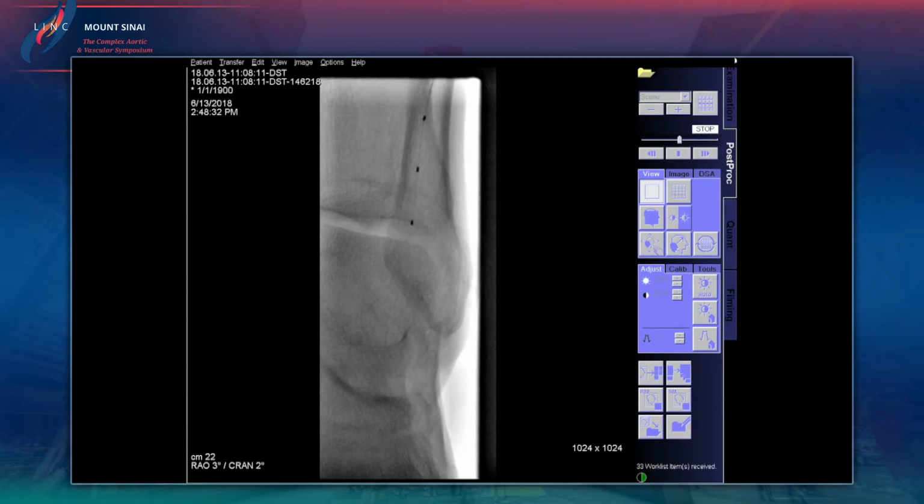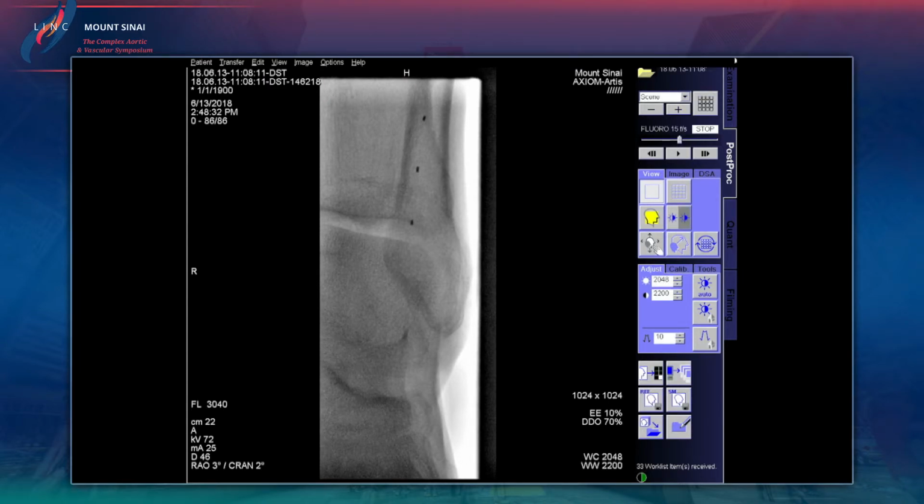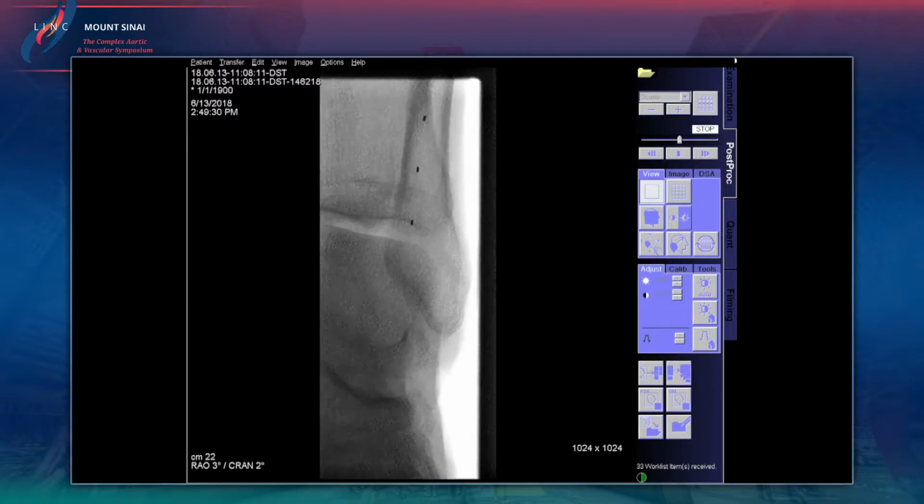So now I've gotten the transit catheter into the foot. So I want to take a DSA in the same projection. Can I have some vasodilators, please? 50. So I'm going to give some nipride into the foot. And I think this is also another important thing that we do a lot. We just give a lot of nipride to be able to see what's going on.